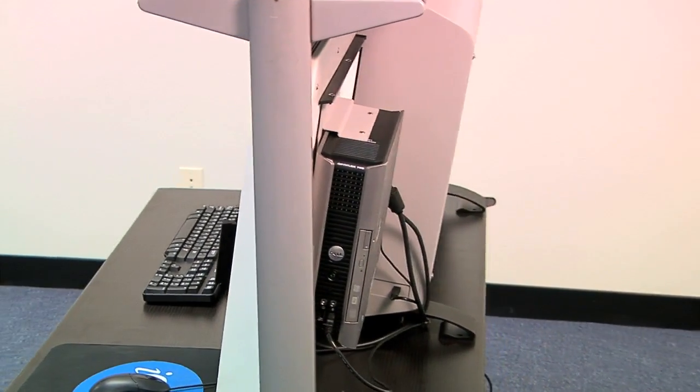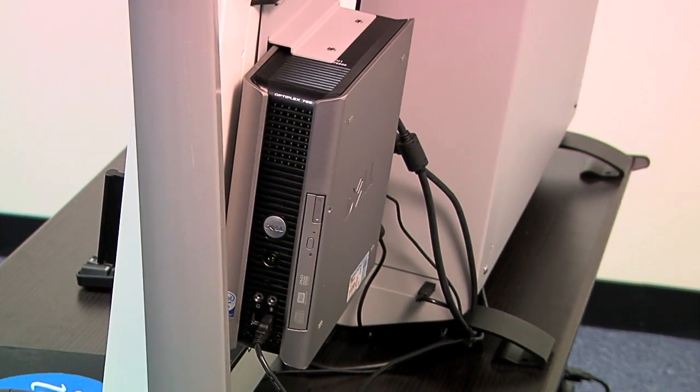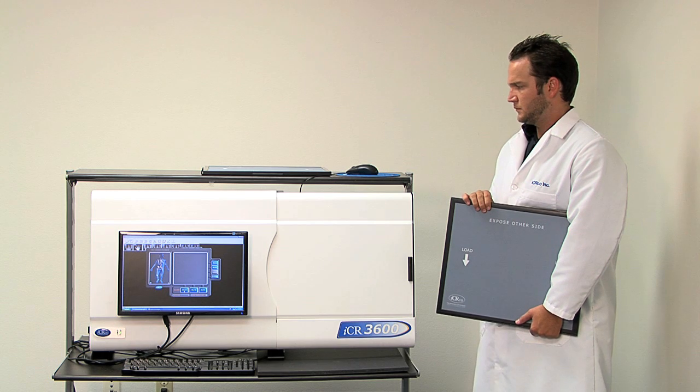ICR 3600 can handle all size cassettes, weighs only 78 pounds, and can scan 94 images per hour.